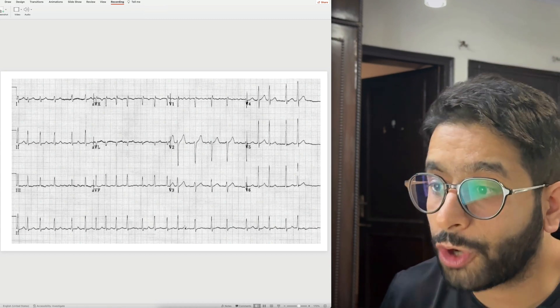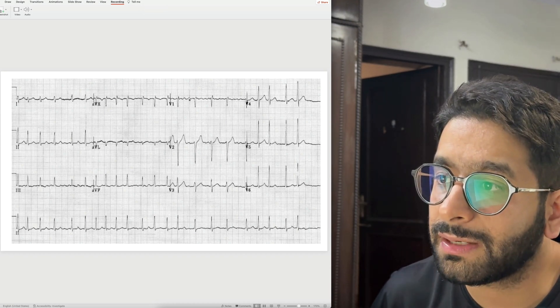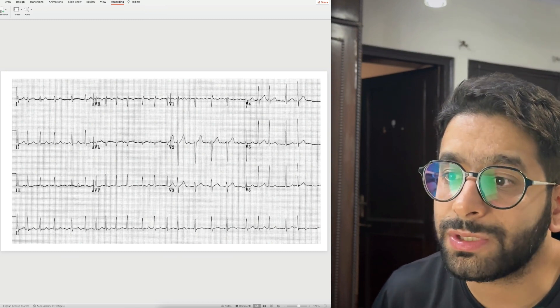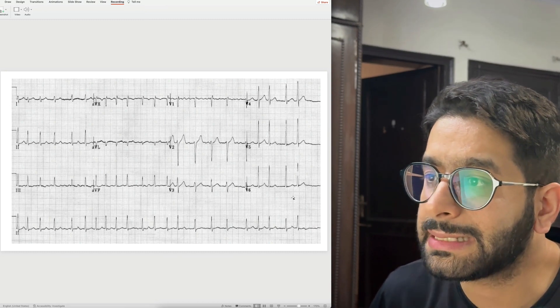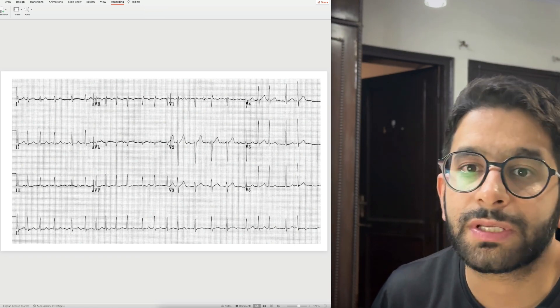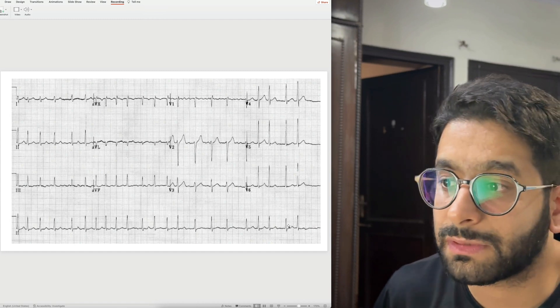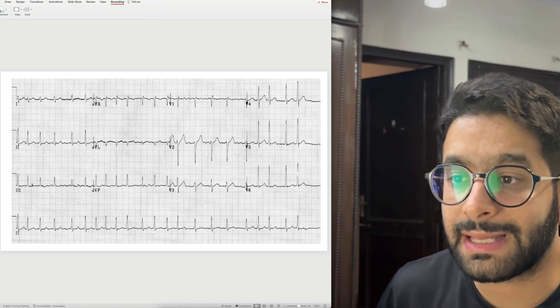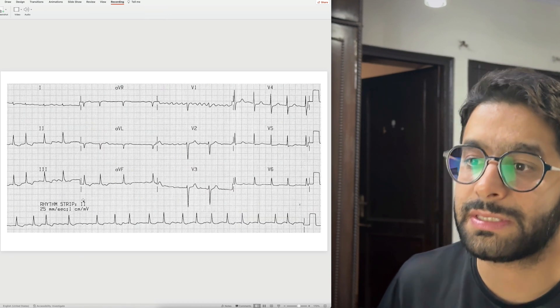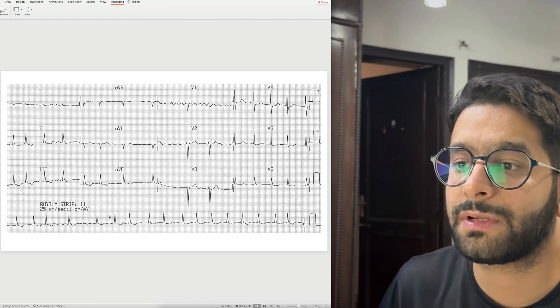How easy is it to recognize atrial fibrillation? The QRS complexes are irregularly irregular, you cannot clearly find a P wave, and instead you may see small undulations — these are fibrillatory waves, not P waves, with different morphologies in all leads. The RR intervals are clearly irregular. Here's another simpler ECG: again narrow QRS complexes, no clear P waves, irregularly irregular rhythm — the diagnosis is atrial fibrillation.